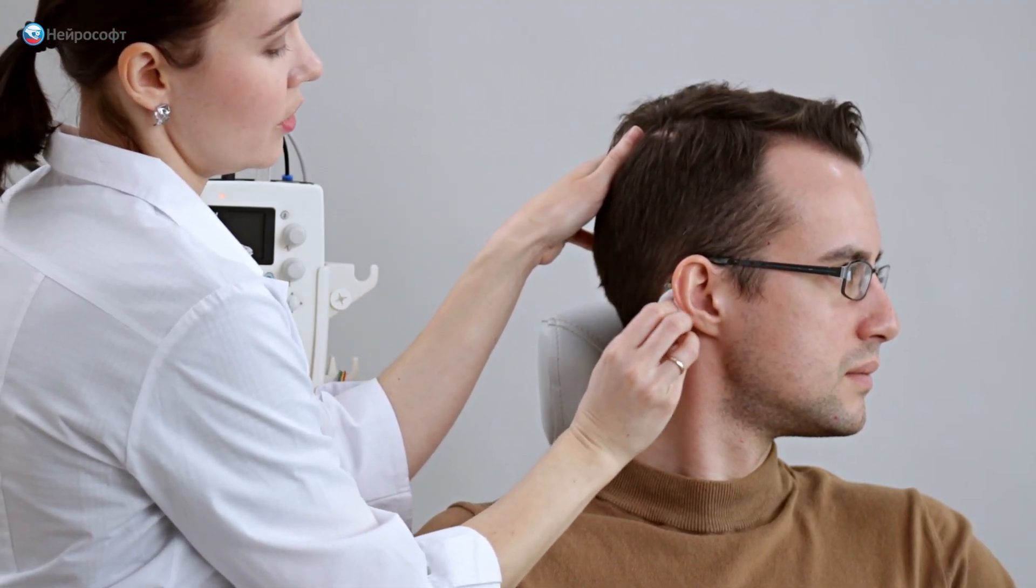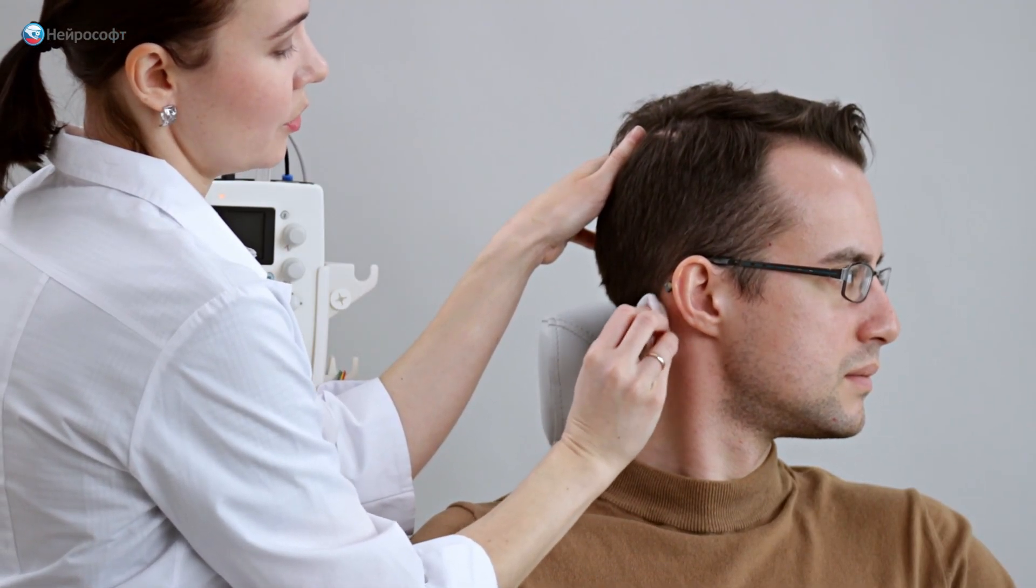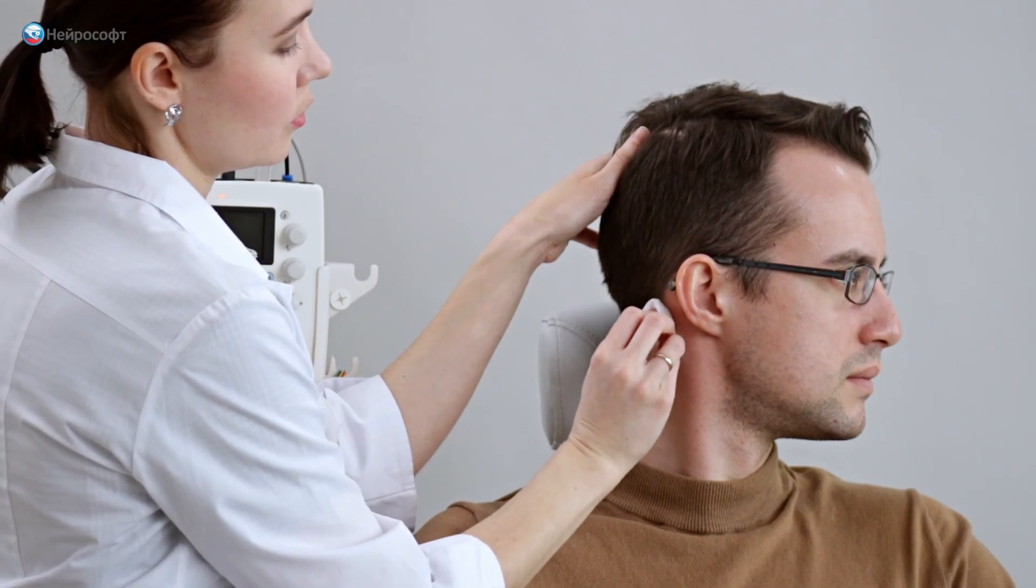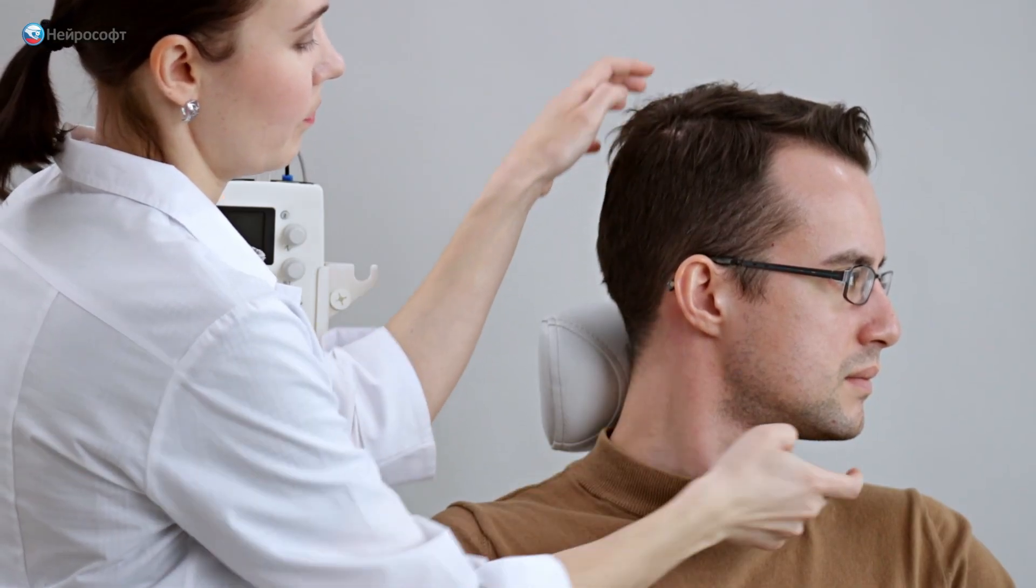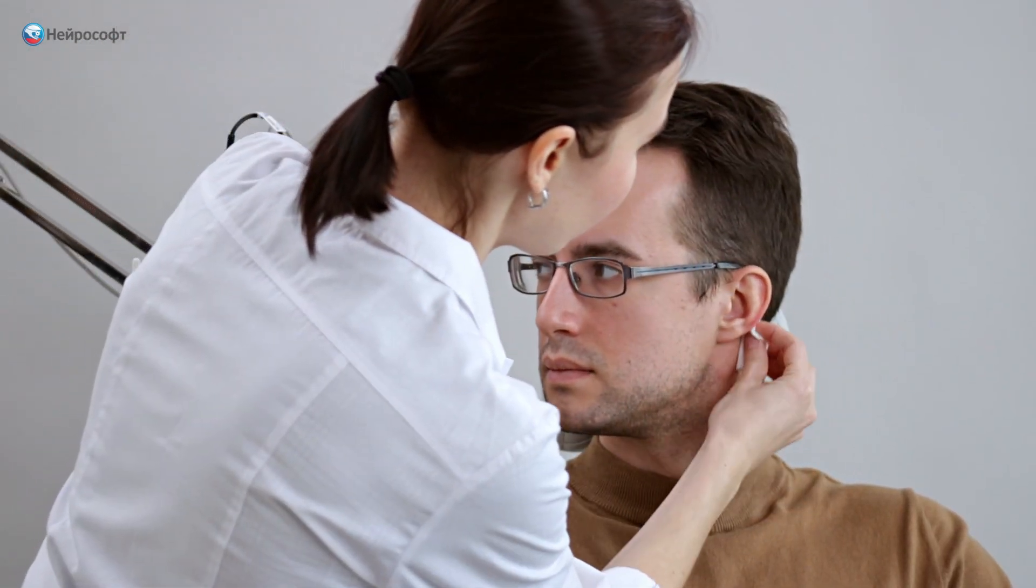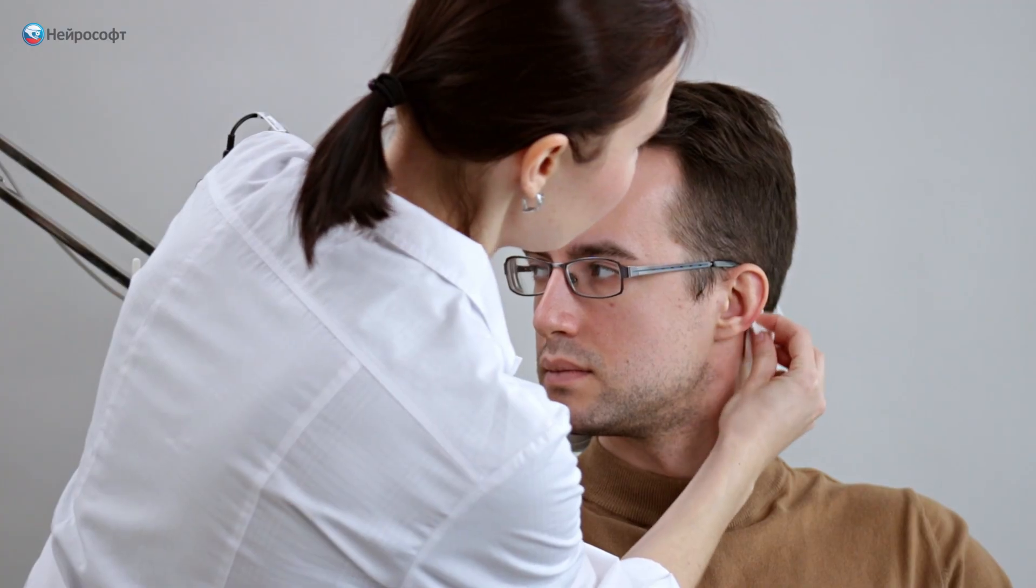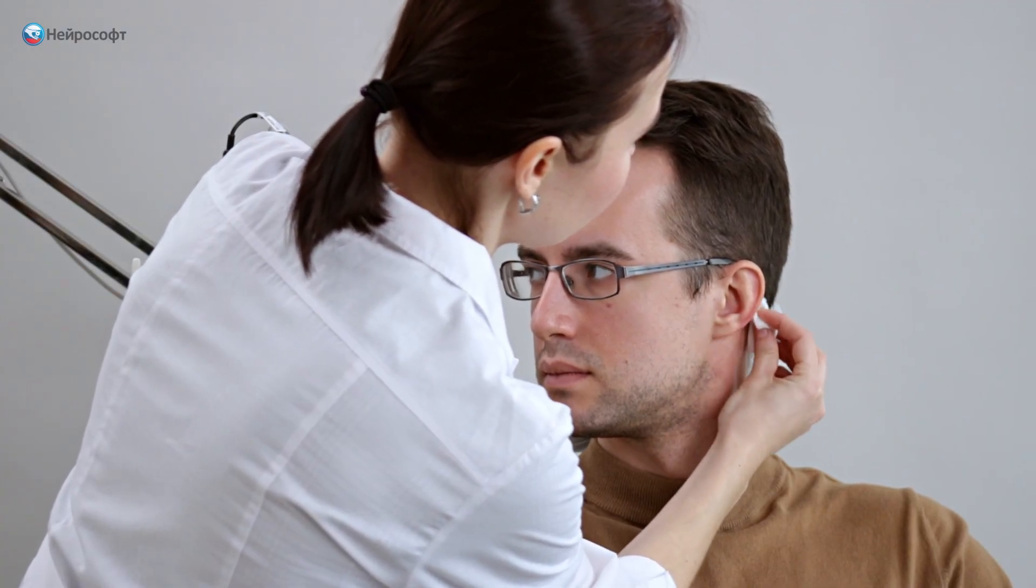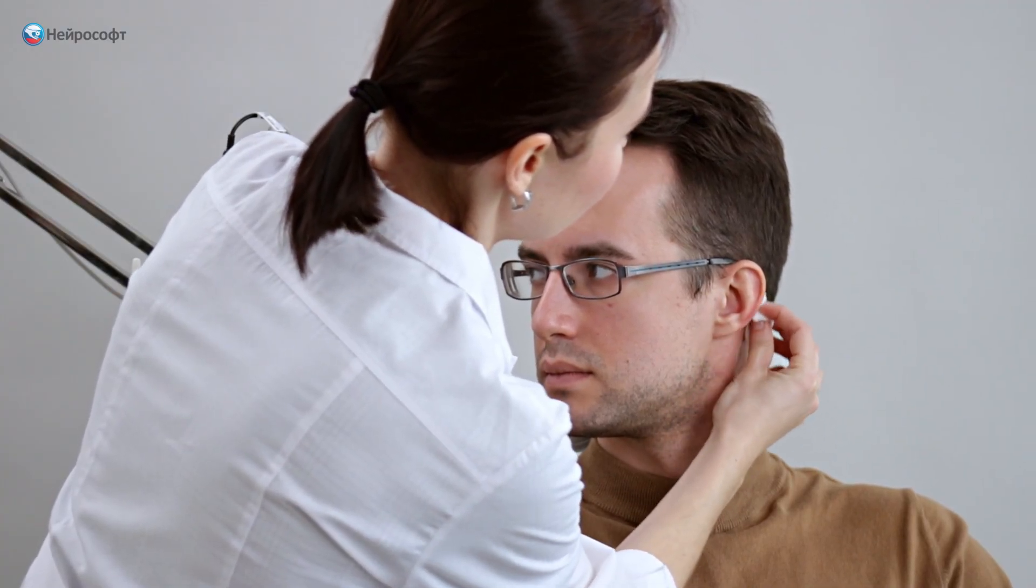It is desirable to achieve a level of subelectrode impedance within 2 kilo ohm. The lower it will be, the more qualitative response we will register.